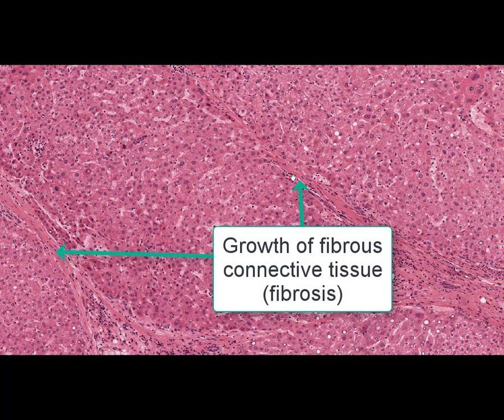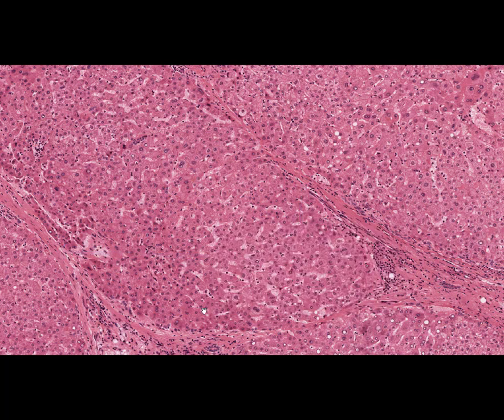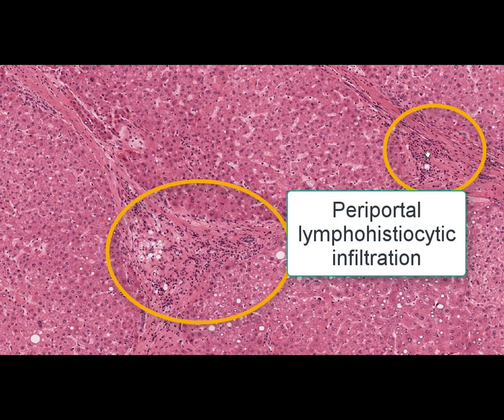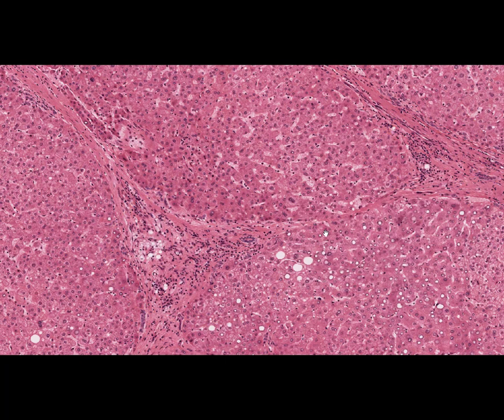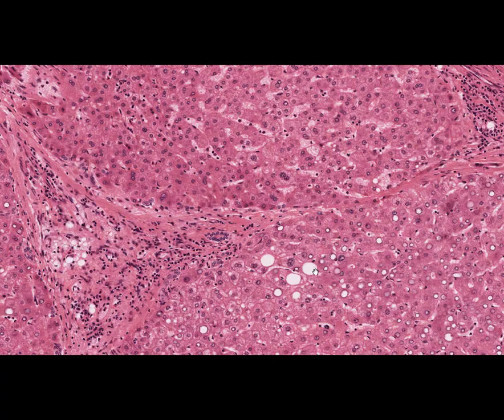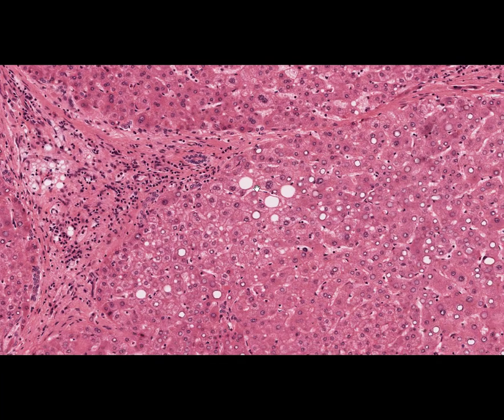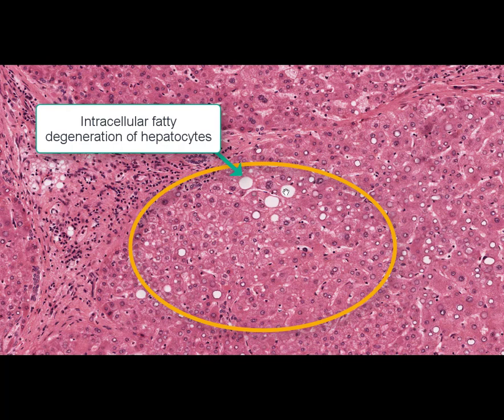We can also see growth of rough fibrous tissue around the lobules, mainly around and along the portal tracts. Lymphohistiocytic infiltration is also found there. Some hepatocytes in those lobules undergo degenerative and necrobiotic changes, in particular changes typical for intracellular fatty degeneration.